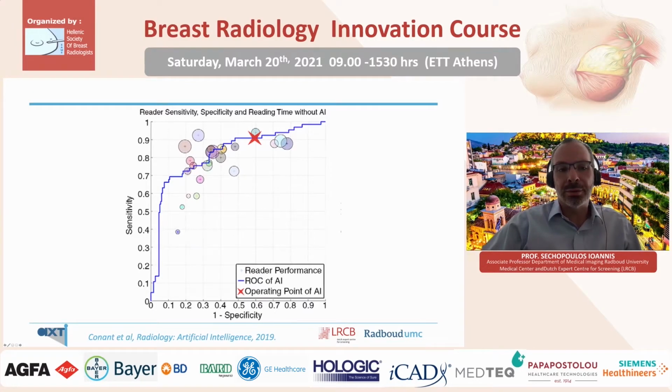We're not the only ones who've tried this. The group in Malmo, again, also tried the same strategy. And they also went back and looked at the 8 cancers that the AI pre-selected as normal, and the 8 cancers were clearly visible. So that's good news. I mean, it's bad news for today, but it's good news for the near future, because hopefully if the cancers were clearly visible, the AI could be improved in the short term, and we wouldn't have those easy errors that the AI makes.